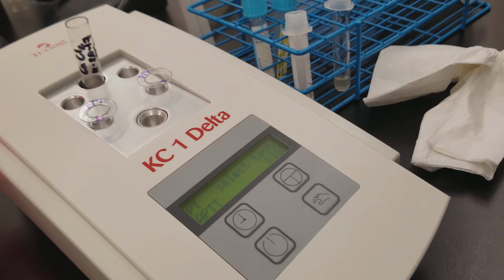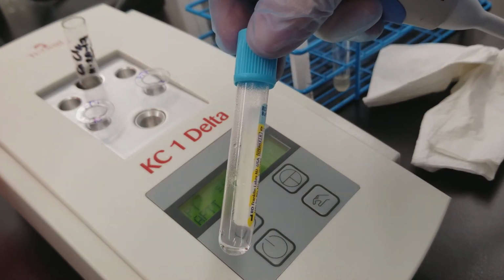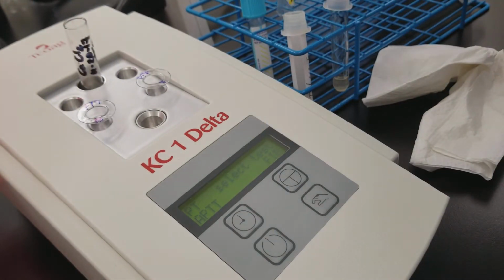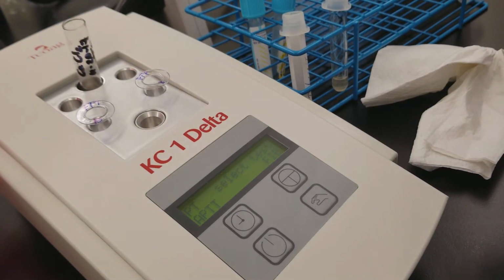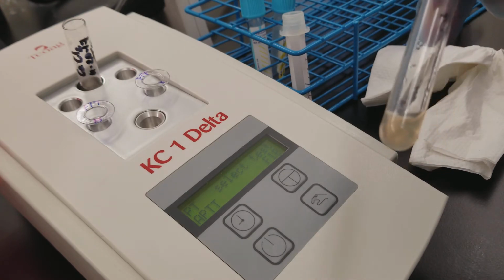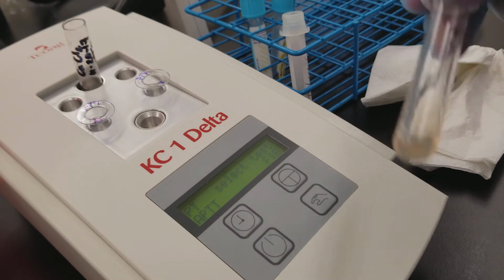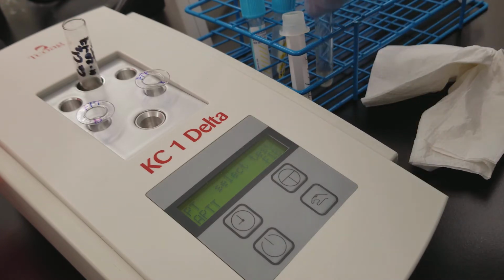The reason that they're frozen is because we get these from one of our clinical affiliates. They're very, very kind enough to support us in this program. And they took off the blue top. They took the plasma off so we would have something to use in class. And it's frozen so that we don't lose the labile factor. And I want you to look that up. Which one's the labile factor? We don't want to lose the labile factor so that we have accurate testing in class.